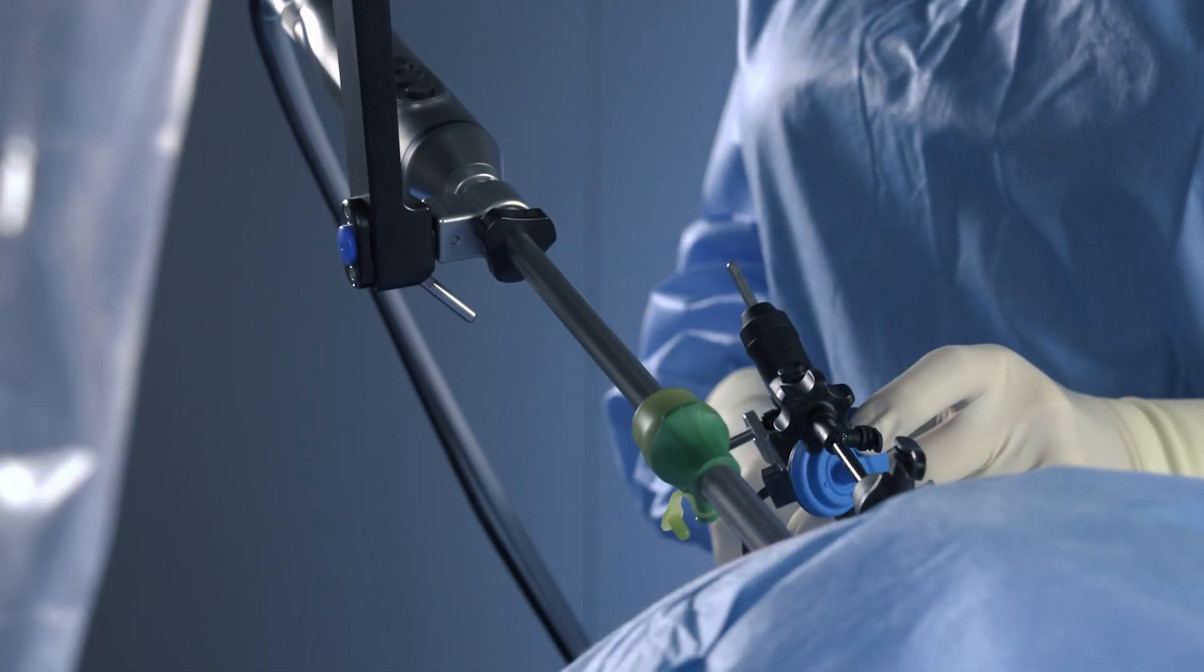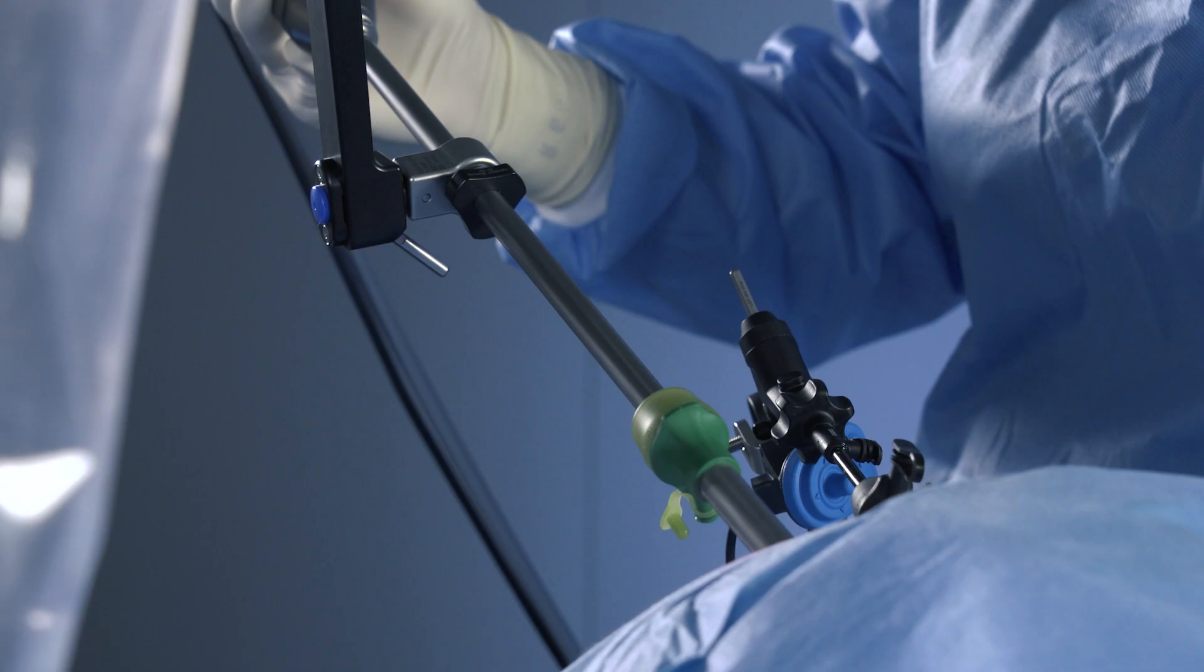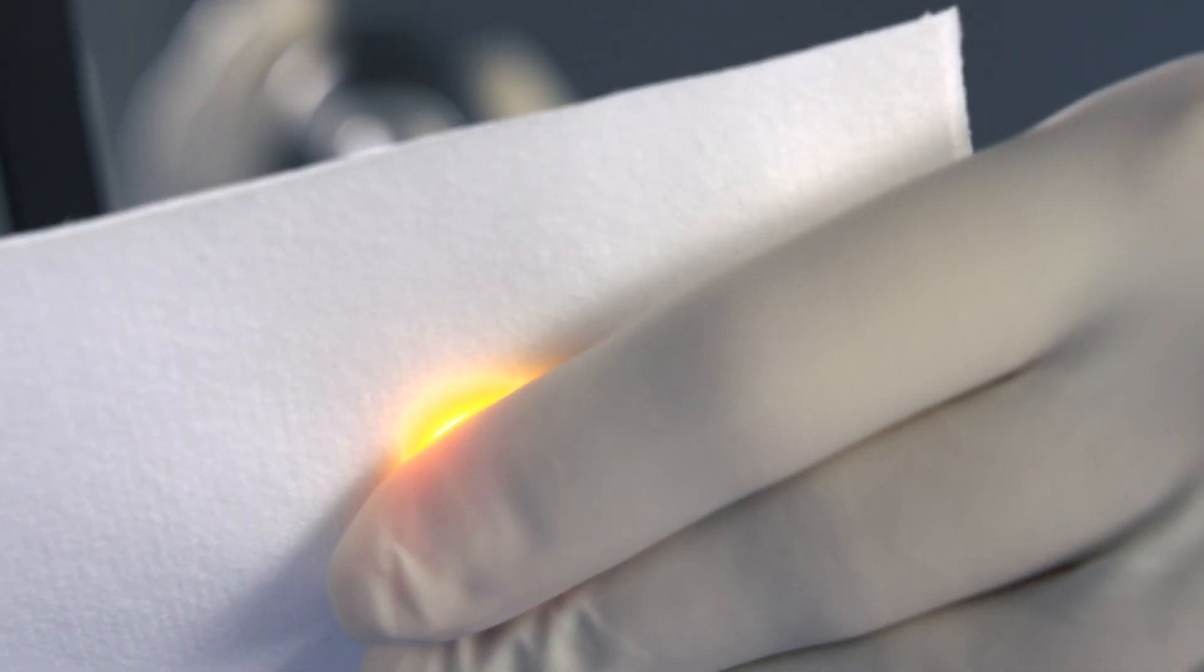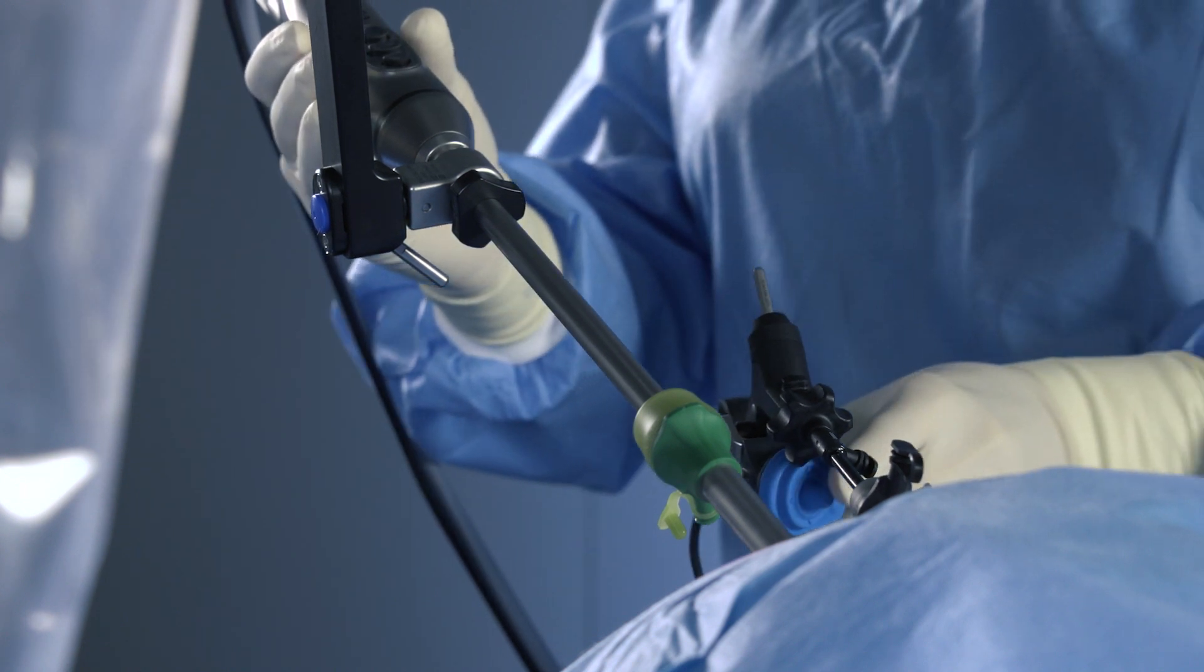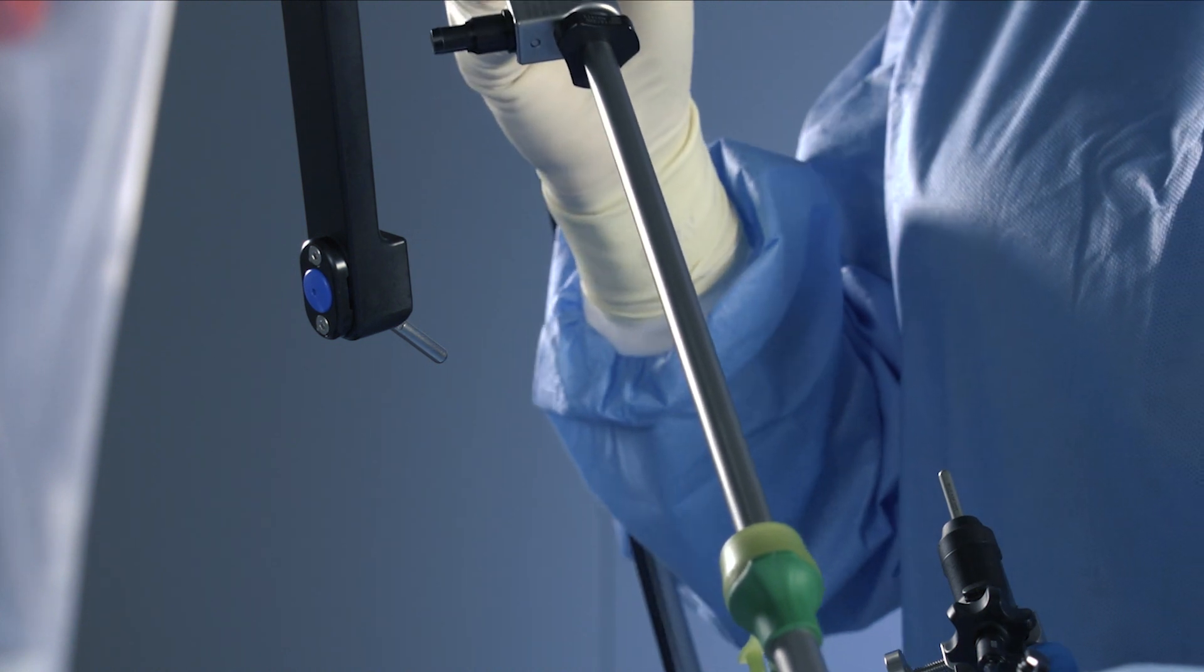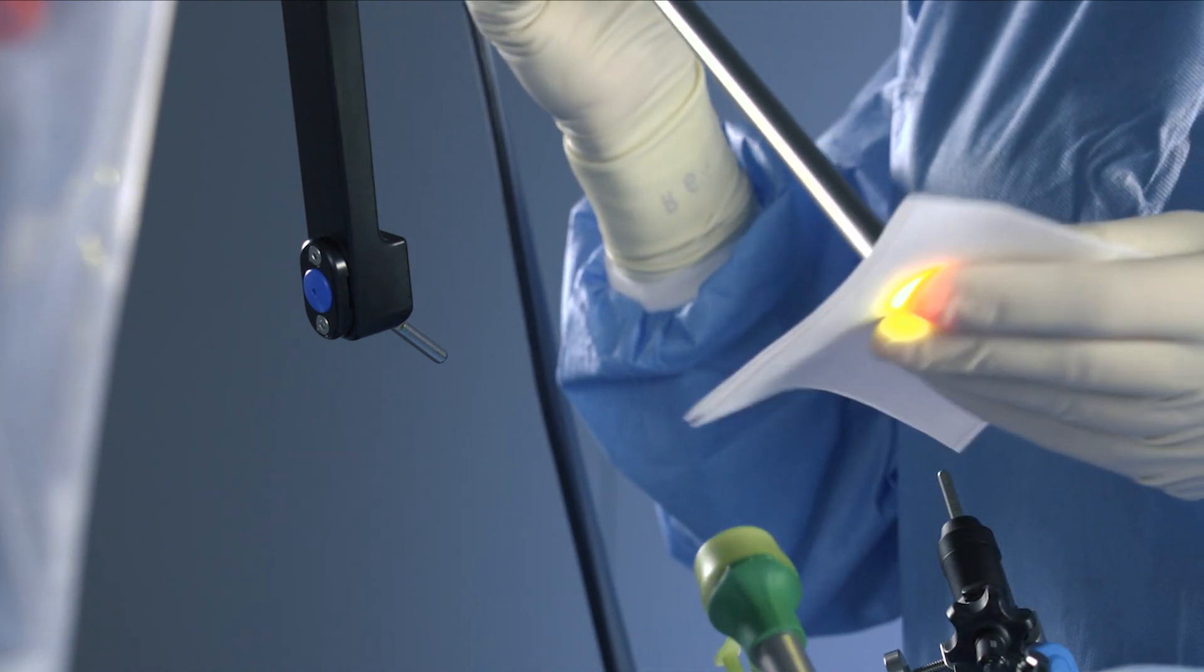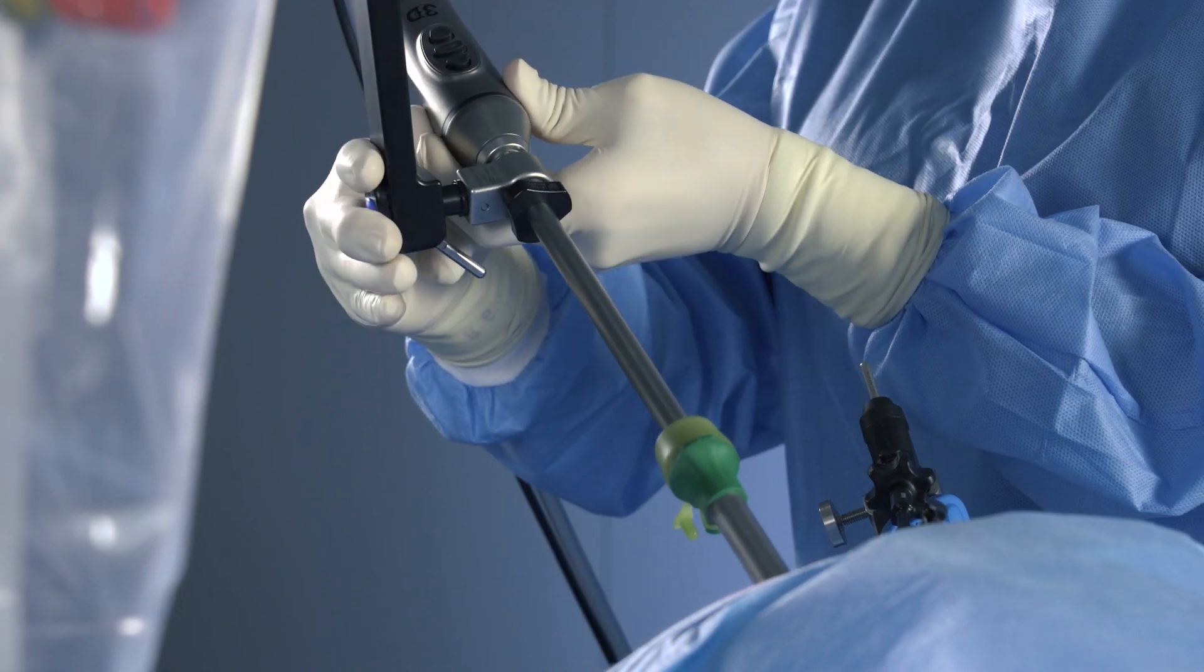For cleaning purposes, loosen the tension sleeve enough to allow the endoscope to be pulled out of the trocar. After cleaning, reinsert the endoscope in the same position as before. As another option, press the unlock button on the universal joint and pull the endoscope clamp out of the universal joint. After cleaning, you can attach the endoscope again.